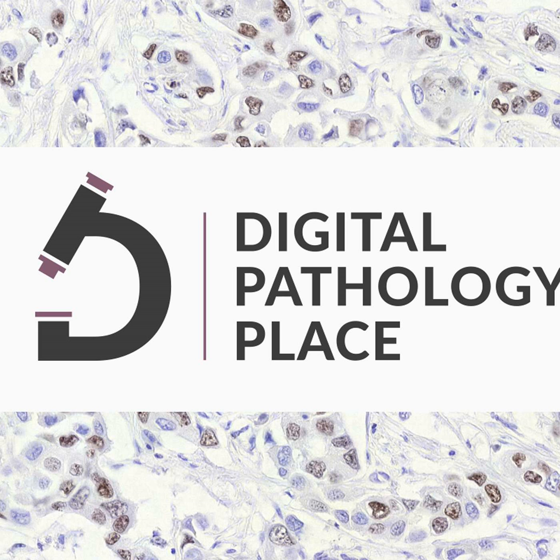Sure. So we like to pull information from as many sources to save the pathologist time as possible. It's a lot easier if those start out structured. For example, genomics reports coming back from the lab, it's tough to see something that's so high tech, when you think about what they're doing to sequence a whole genome or next gen sequencing, and then send it out as a PDF that's 50 pages long. So a pathologist may be reading through that, pulling out relevant bits and pasting them into their report.